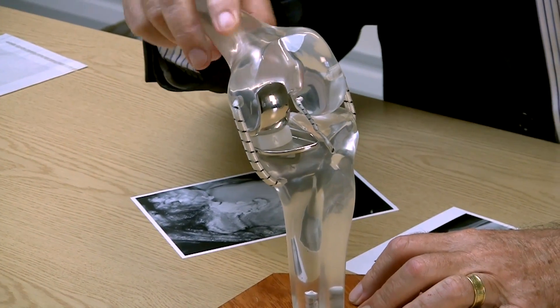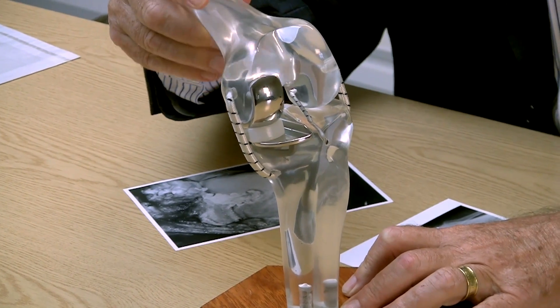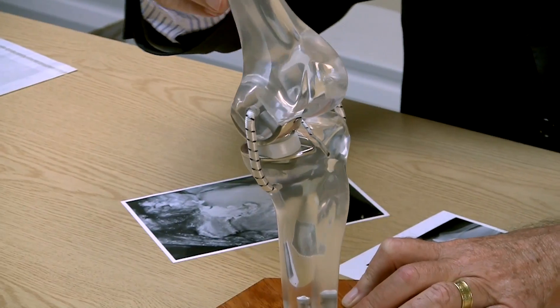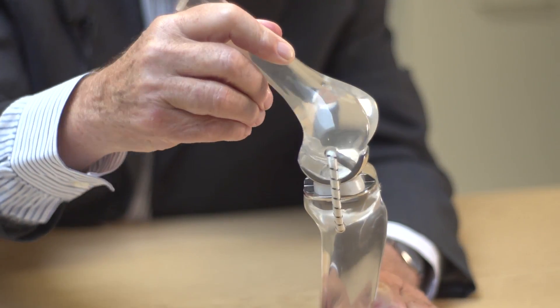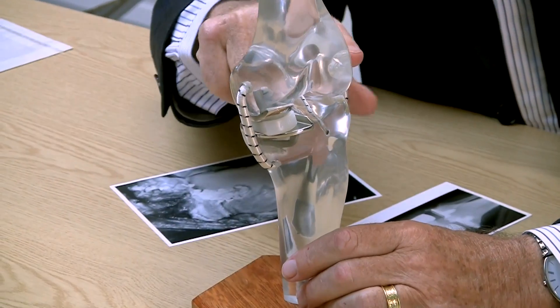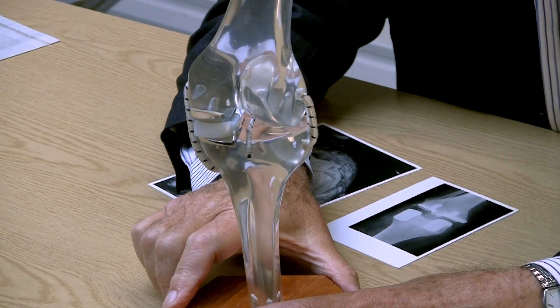The unique thing about this is that if you look at the model from the side, as the joint bends and straightens, the plastic bearing can move backwards and forwards on the tibia. It can slide freely relative to both the femur and the tibia. And when you twist your leg, which we do quite a lot in activity, it can slide backwards and forwards so that the bearing accommodates to the movements of the knee as demanded by muscles and ligaments, while at the same time remaining in full conformity with the metal components in all positions.